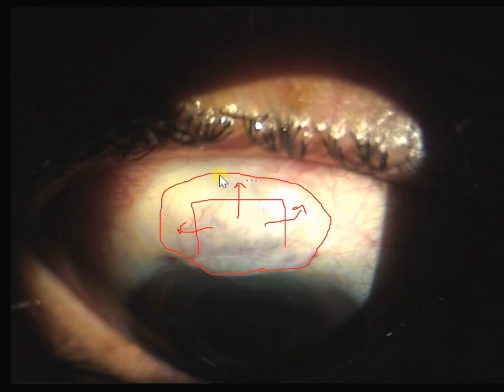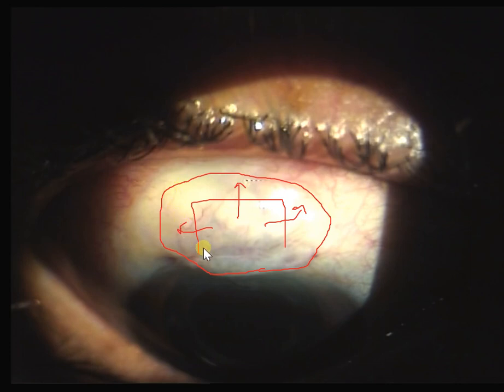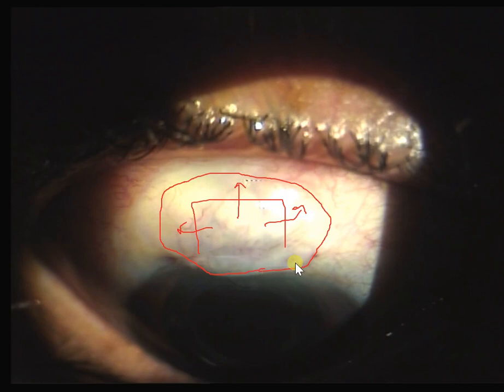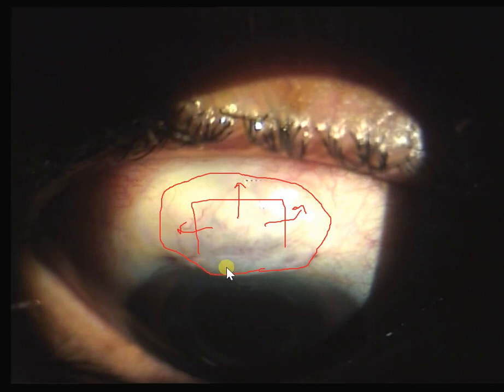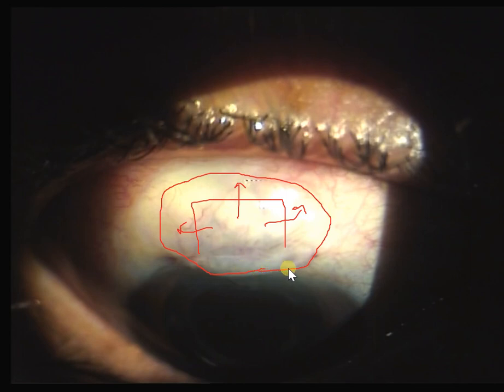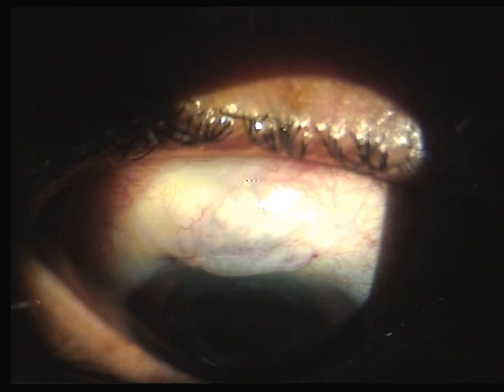To get a good bleb you need to have a diffuse bleb. What we've done here is the surgery was done more on the corneal side, so there's some overlap or forward advancement of the conjunctiva onto the cornea at the limbus. Now we go ahead and look at the bleb using the slit lamp.